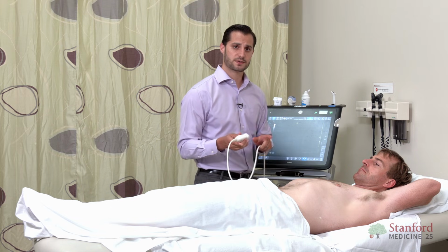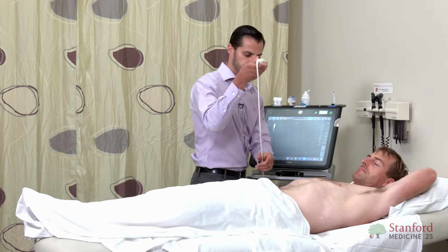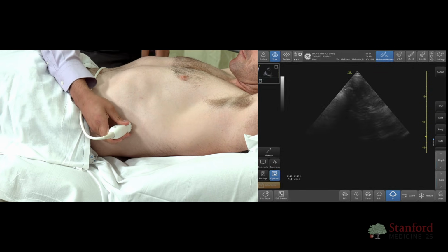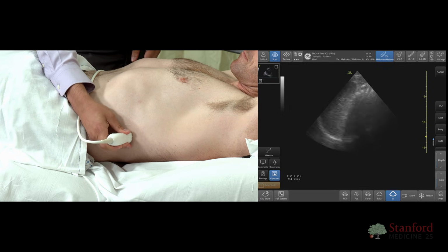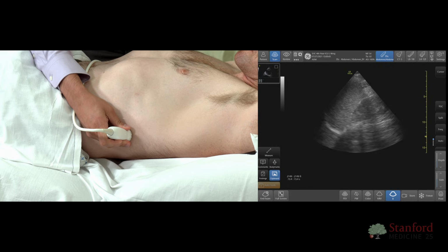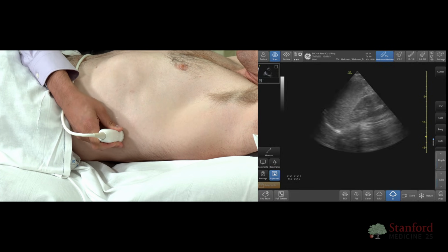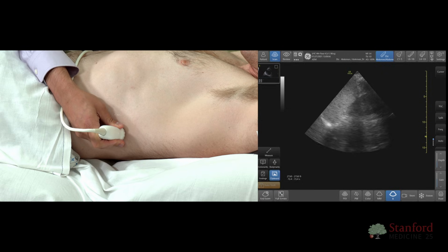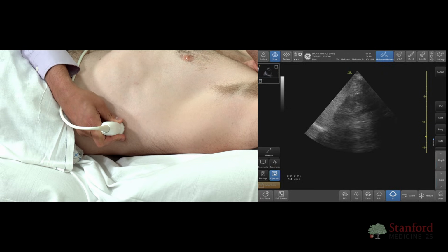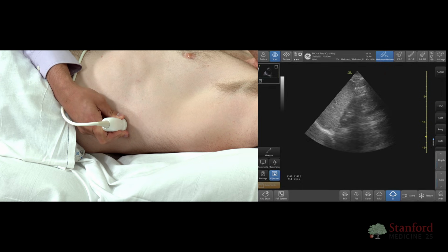Again, my marker is pointed towards the patient's axilla. The patient's left arm is behind their head. And I'm going to generally be in the mid to mid-posterior axillary line. When I'm scanning, one of the things I want to do is point my probe a little bit more posteriorly towards the back of the patient, again because the kidneys are retroperitoneal organs. Here we can see the left kidney, we can see the cortex, the medulla, and the medullary pyramids as well. And if I wanted to take size assessments, I can rotate the probe to get the entire picture.